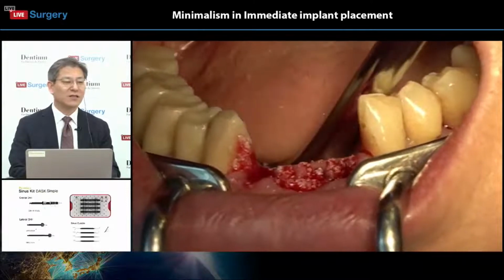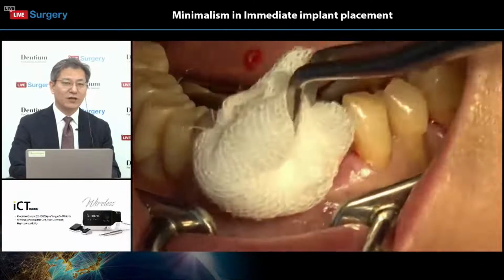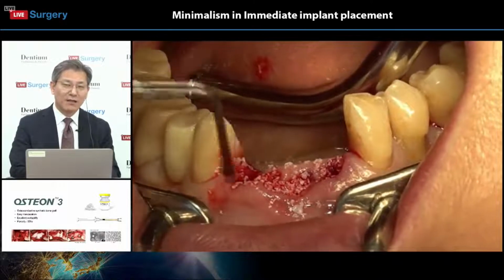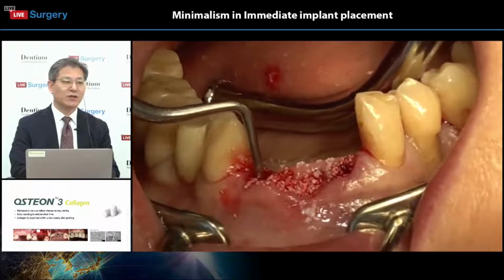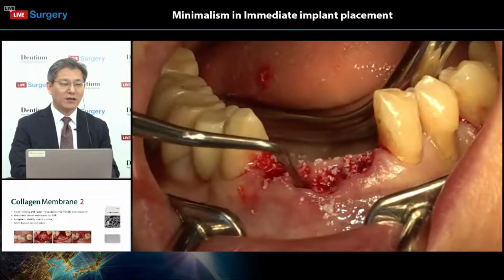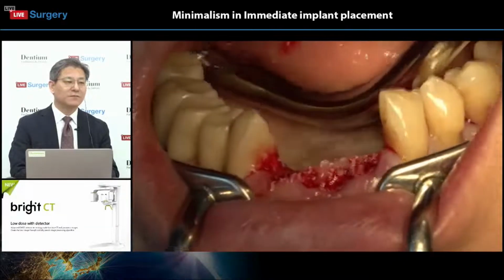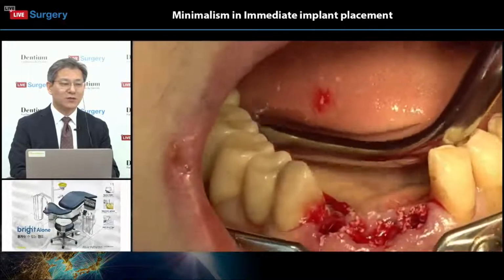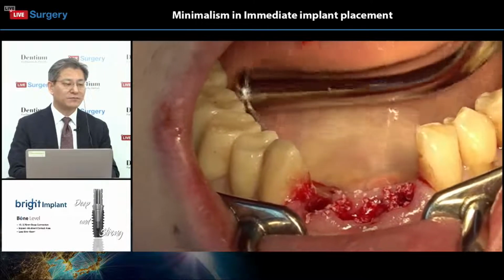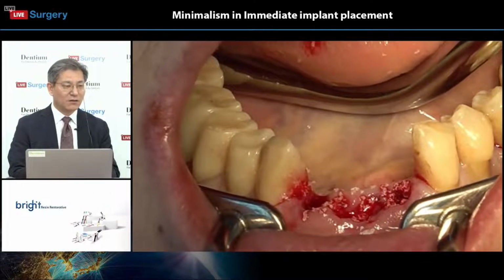And Dr. Chung actually wants to have bone grafting first: drill, bone grafting, and insertion. Why? He wants more compacting of the bone grafting materials between the implant surface and the socket. So with this method, tight packing can be achieved compared to packing after. So Dr. Chung always wants bone packing first and then the installation procedure. Today also, Dr. Chung has bone packing first.